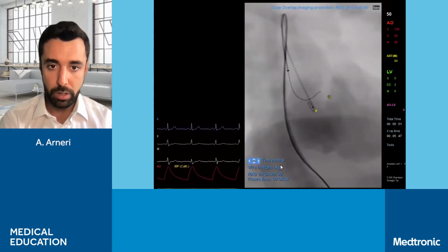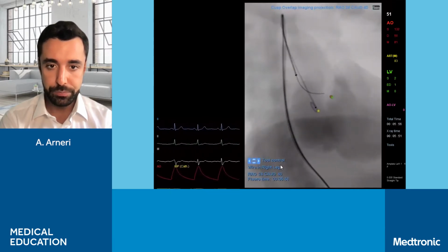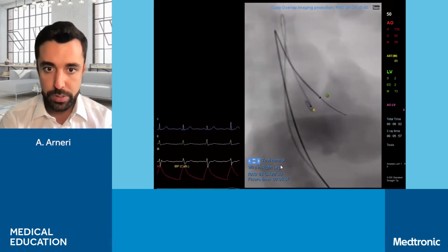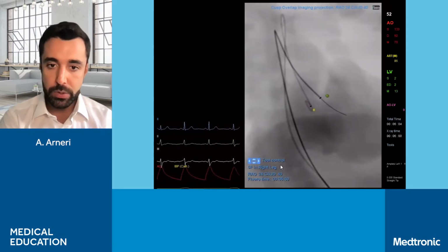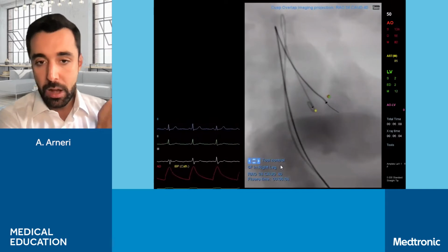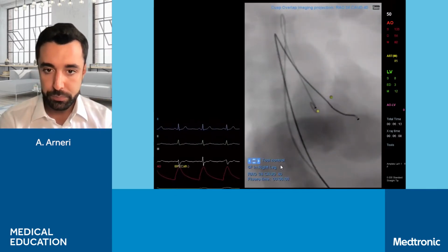Okay, now we keep trying to go into the ventricle. Okay, you see now we are into the ventricle. So George succeeded to do that. We have the straight tip wire into the ventricle. We have the AL1 right above the aortic valve. What we're doing now is going a bit more into the ventricle with the AL1, okay?